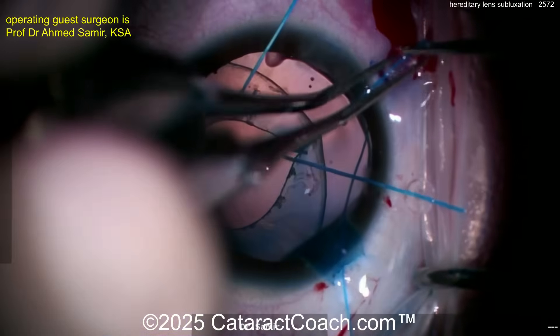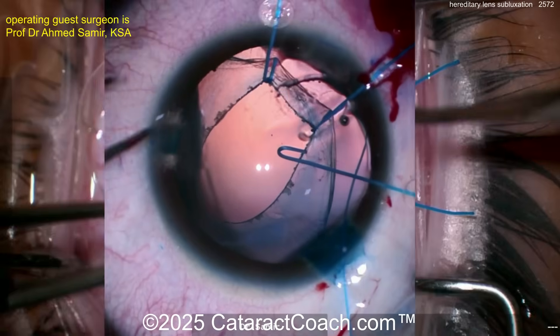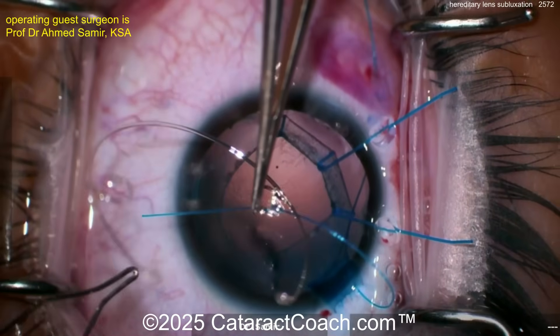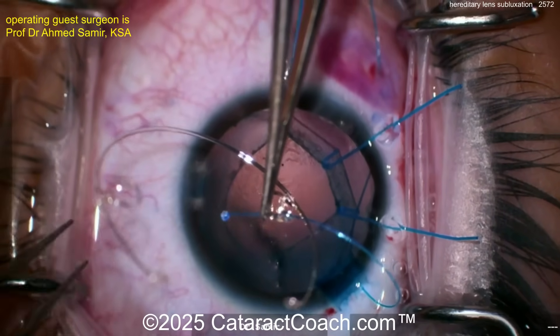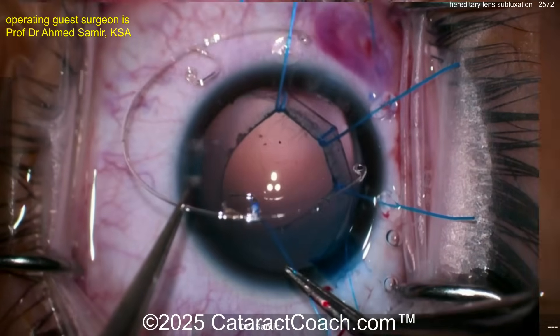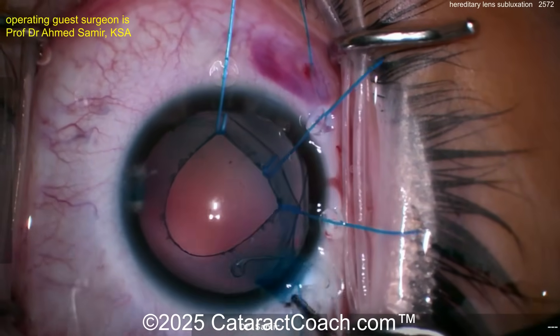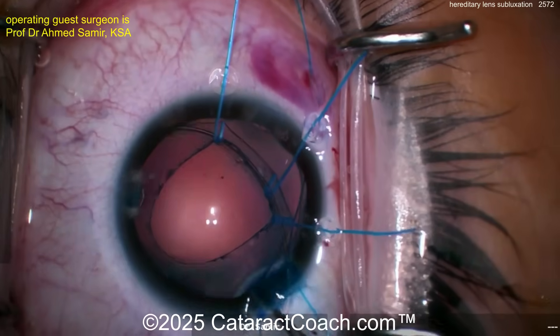Are you going to put in two capsular tension segments, or a big CTR and then segments? Here comes the Cionni ring — a double Cionni ring! Look at that — two points of fixation. A little cautery here on the prolene for the flange technique. You see how this CTR has two little extra loops with eyelets — that's a double Cionni ring. Now slowly placing this in the capsular bag like a CTR — beautiful.